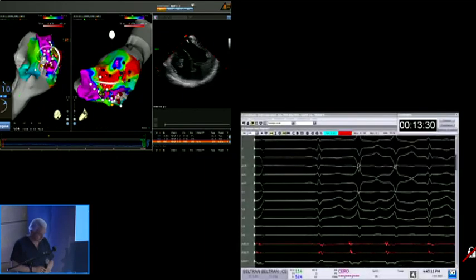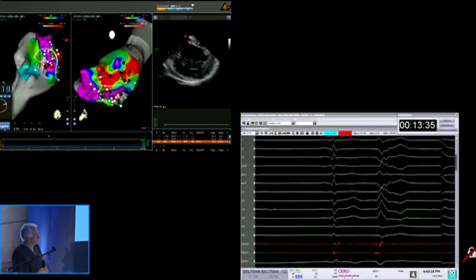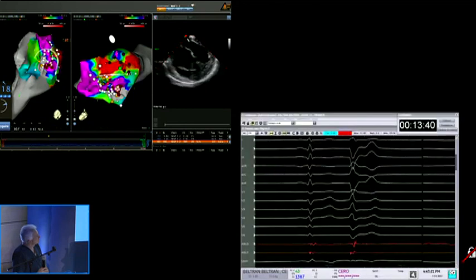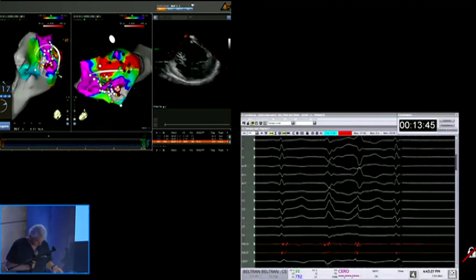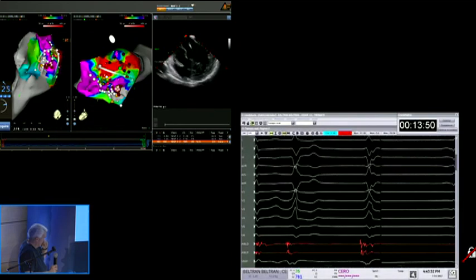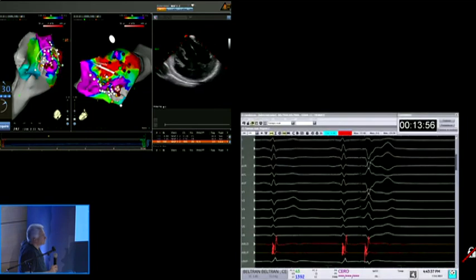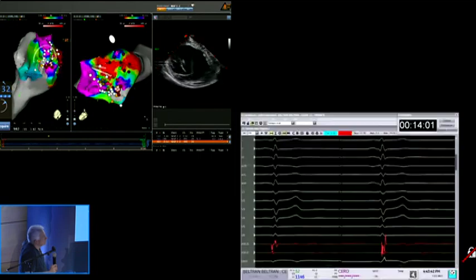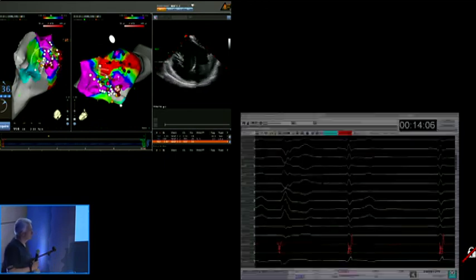So rotate, lift the image up. Are we getting the pentarray? Levanta la imagen para arriba. Gracias. Yep. Do we have the pentarray now? Well, I think this is the same, no? Let me rotate a bit. Well, apparently now we are in healthy tissue. Can you choose a point? Well, this looks healthy. I don't know. I'm not sure.